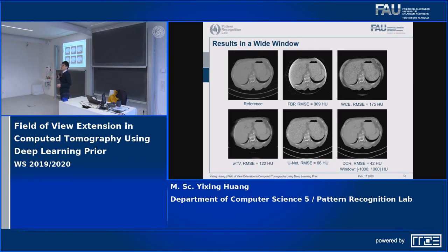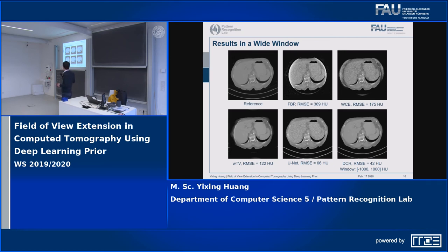Here are results for one example slice. This is the reference image, this is the FBP reconstruction, and this is the WCE reconstruction. The WTV reconstruction shows that the structures inside the FOV are reconstructed very well; however, the structures outside the FOV are not reconstructed. The U-Net is able to restore the anatomical structures outside the FOV — the outline looks very good — however, because it is sensitive to noise, it still suffers from Poisson noise.